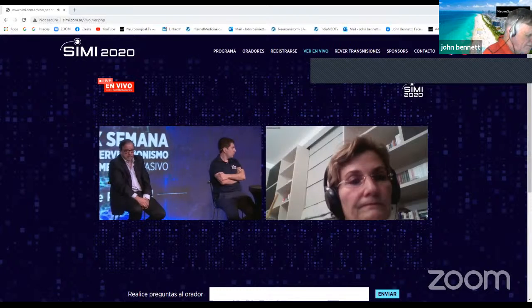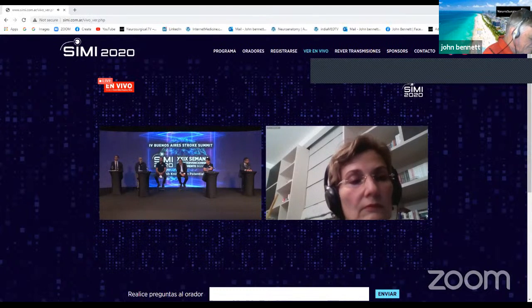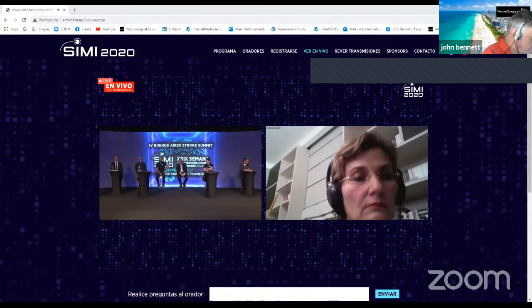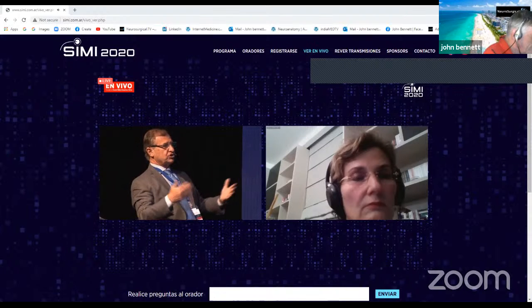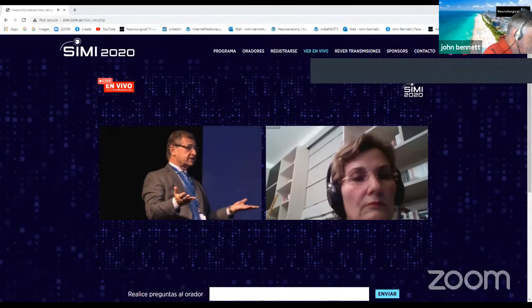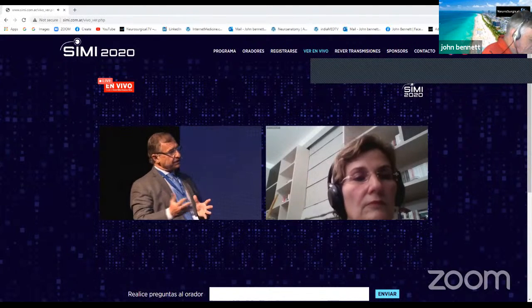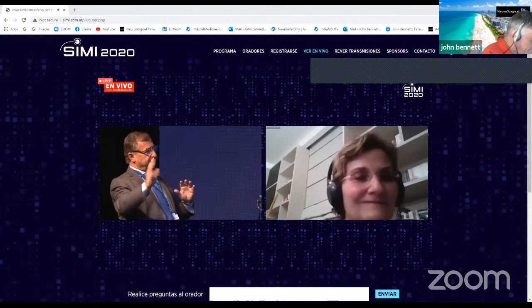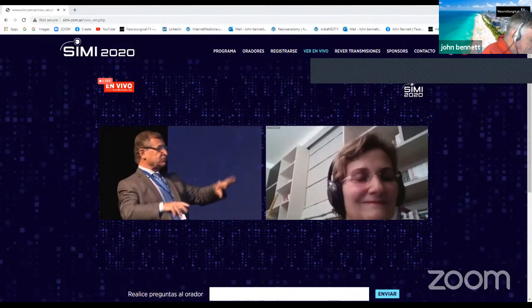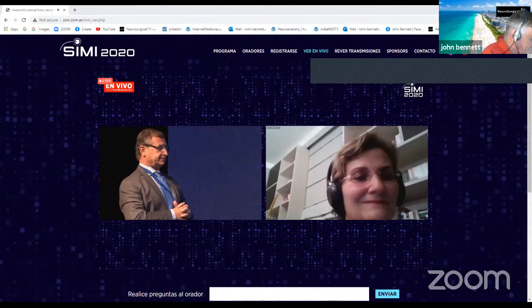Thank you very much, Isil. Well, Isi, when and how often are you using adjunctive techniques when you're using WEB? You know, now a lot of people are using balloons, stents, even flow diverters together with WEB. Are you using them often? When you say, well, this case I will do flow disruption and flow diversion, or in this case, I will use the balloon. We would like to learn about that.